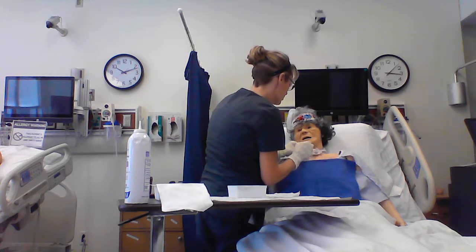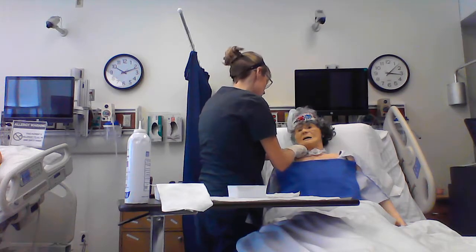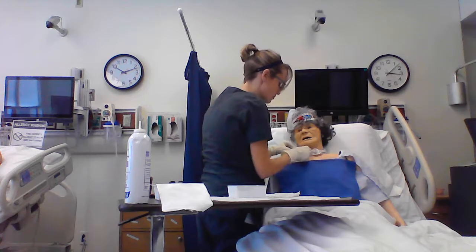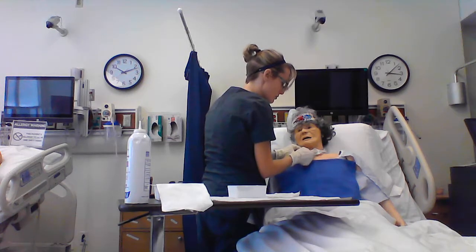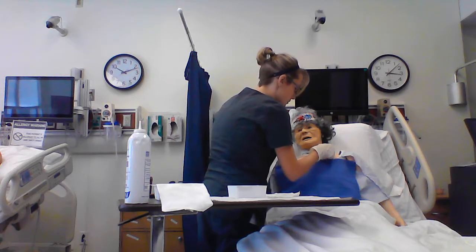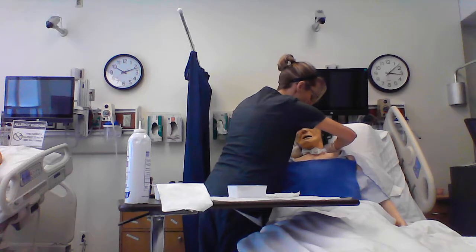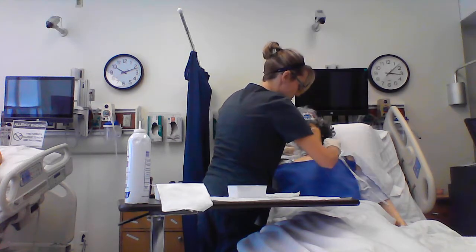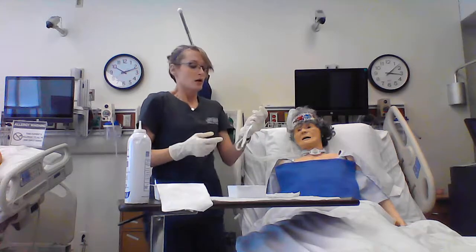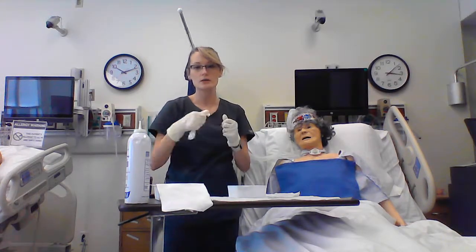Okay, so I pulled her new trach ties through and tighten them down. You want to make sure that you have a finger breadth or two that you can put between her trach ties and make sure you're not cutting off her airway or circulation. And then you can remove these old ties from her. Lift your head for me, Opal. Remove these. And then I would take these, and I would probably also roll them up in my glove. Take these gloves off.